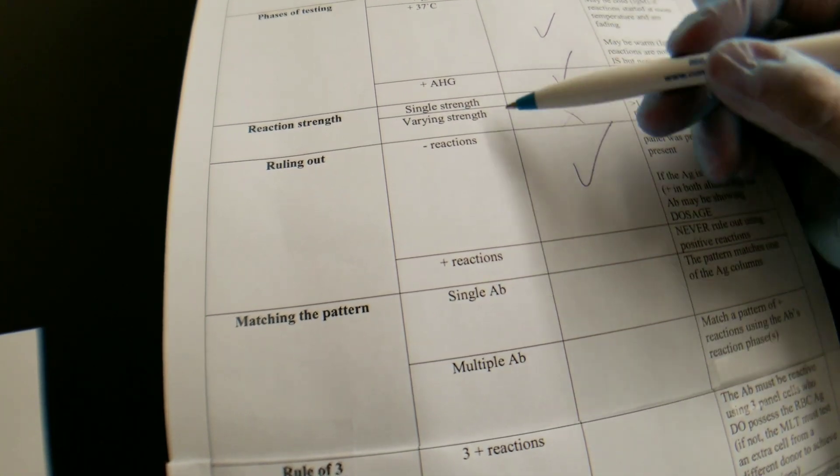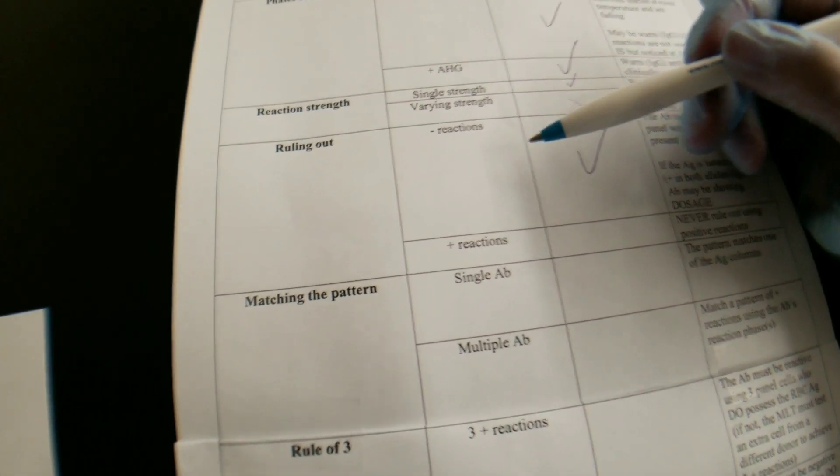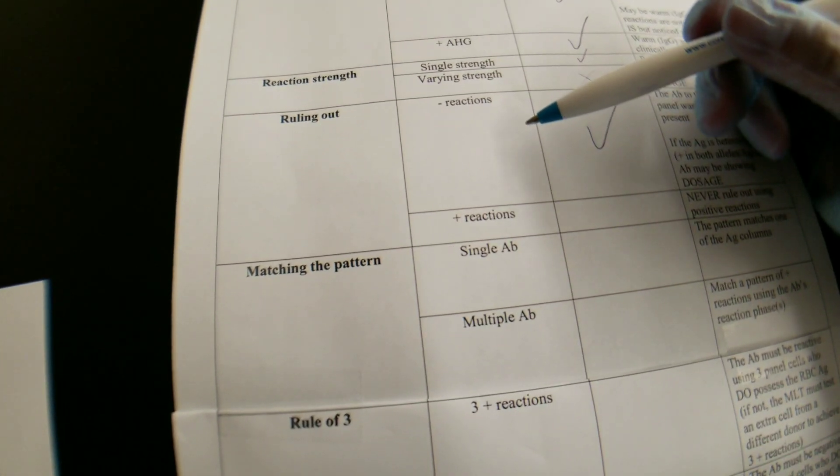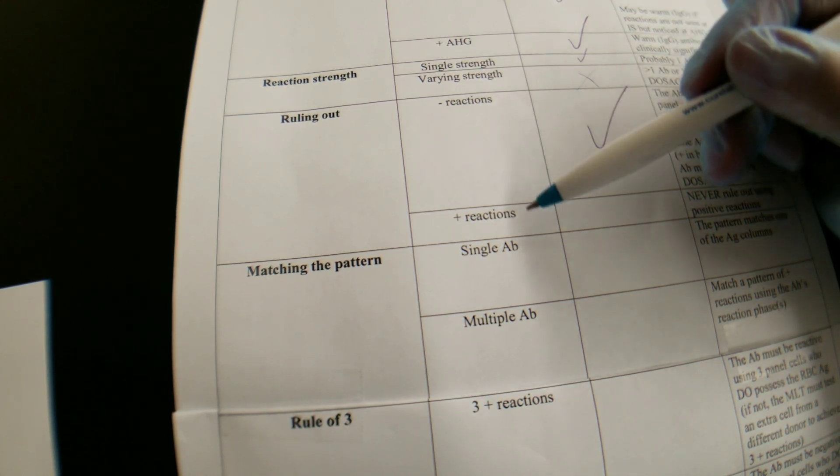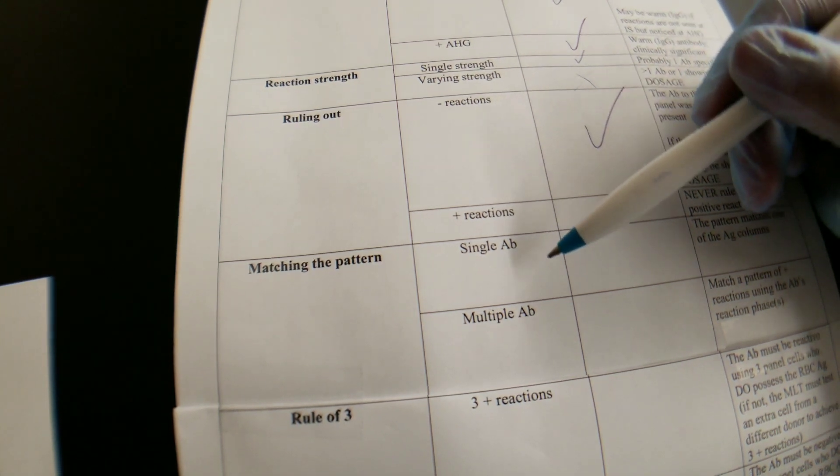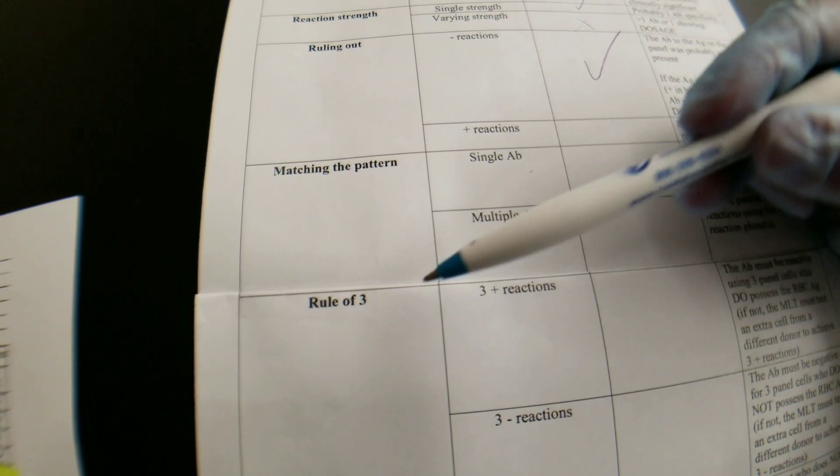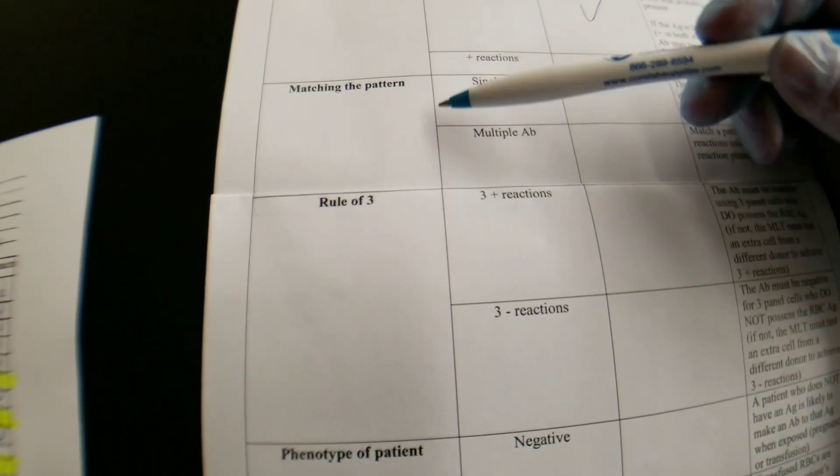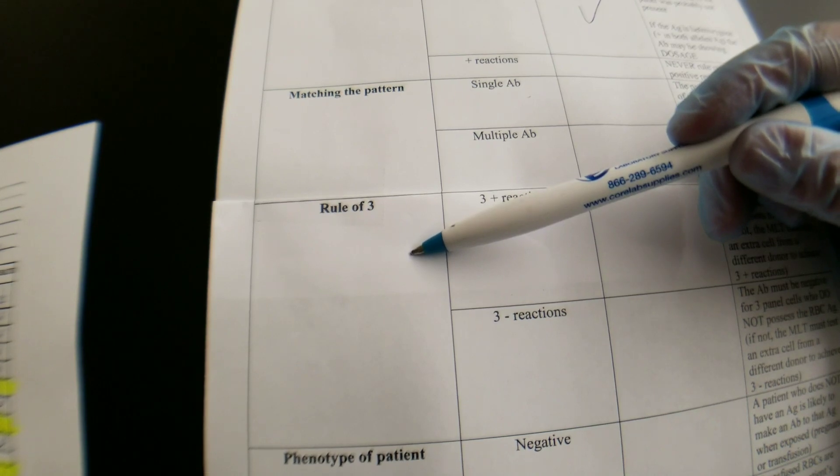Okay, so we can kind of just not use that one. So crossing it off, it would be the single strength. So the next thing we're going to need to do is to rule out and rule in negative reactions and positive reactions. So then we'll match a pattern. Excuse me, we already did that. I was expecting that to be here. So the next thing we're going to do is try to match a pattern and try to do the rule of three.